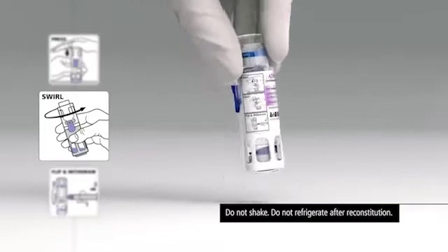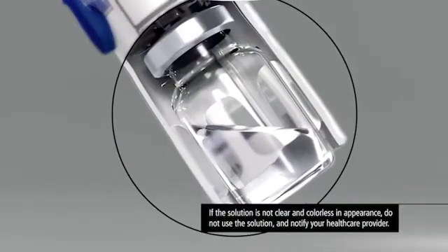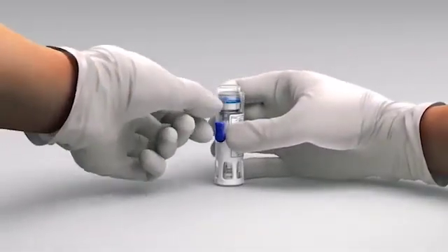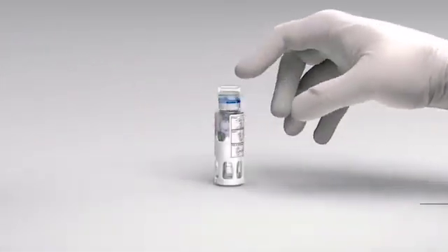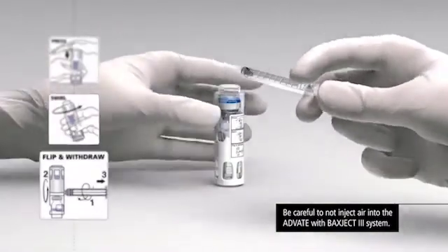Swirl gently until the ADVATE is completely dissolved. The solution should be clear and colorless. Remove the blue cap. Take the syringe and push the plunger all the way in.